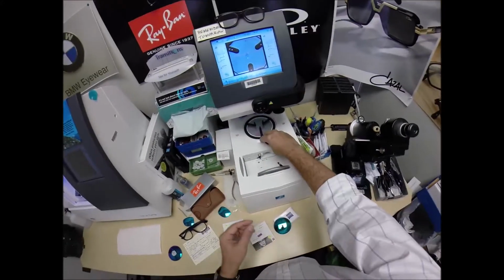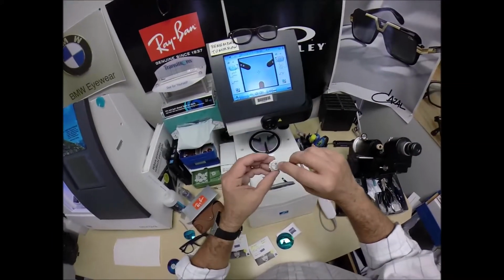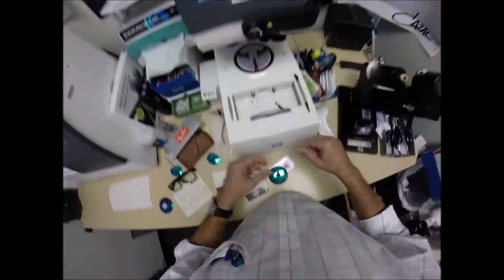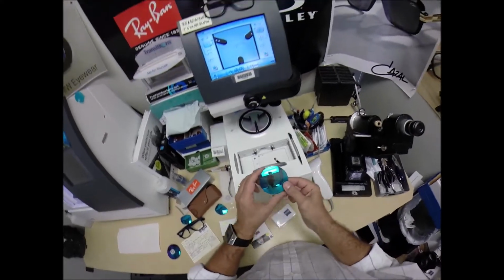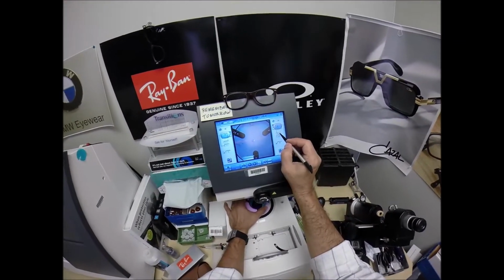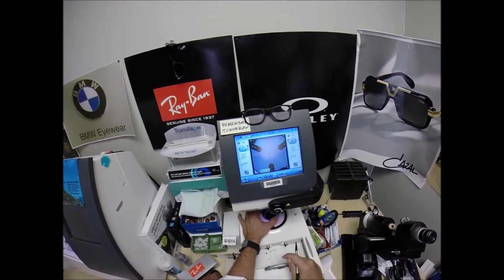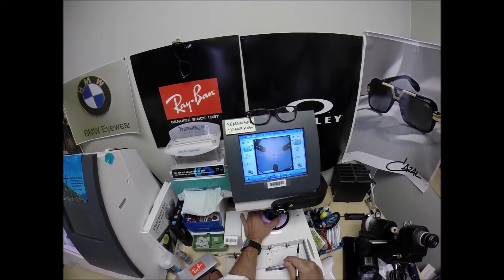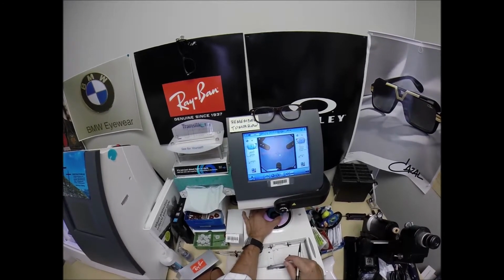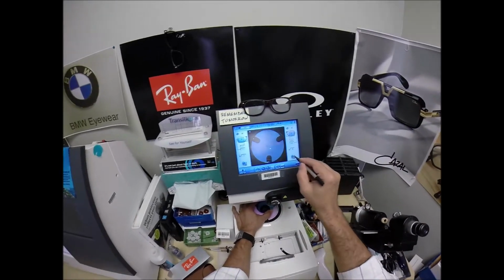We're going to do the same thing now for the lens that ain't right, which I can identify with. I ain't right either. Pull the sticker away, line up the magnet, put the left lens onto the platform. Same pupillary distance that has mirrored from the right side. Same optical center height. If it was different pupillary distance, I would have to enter that. Rarely do I ever change the optical center height.